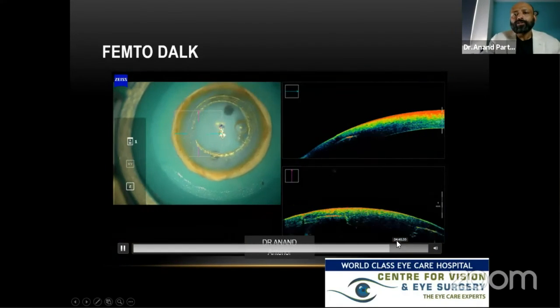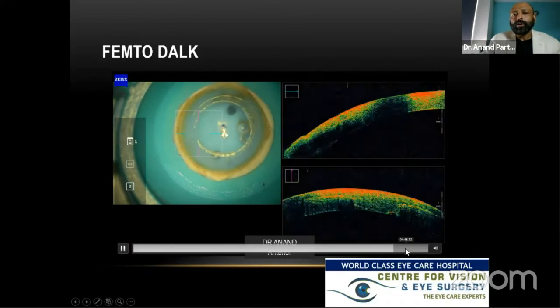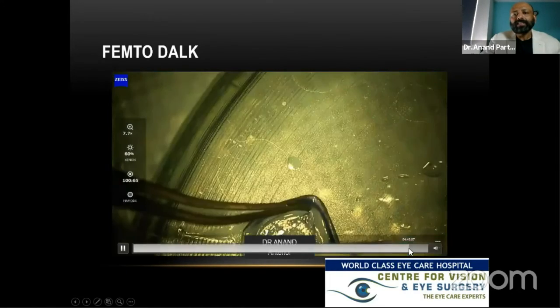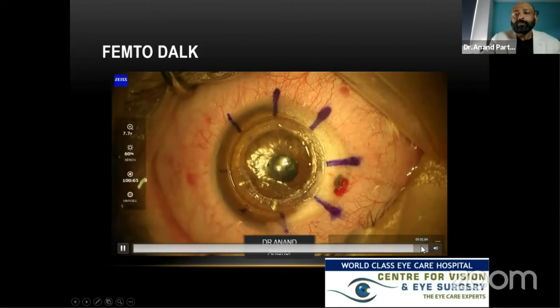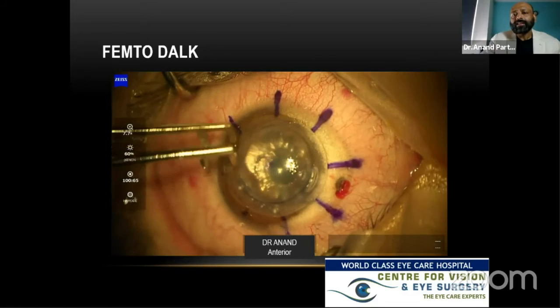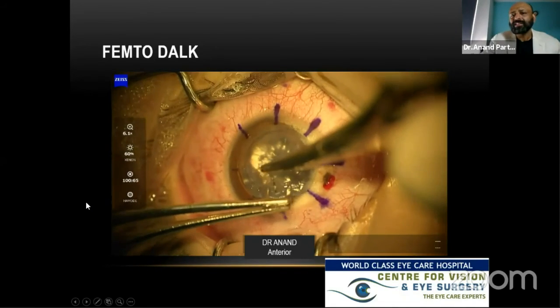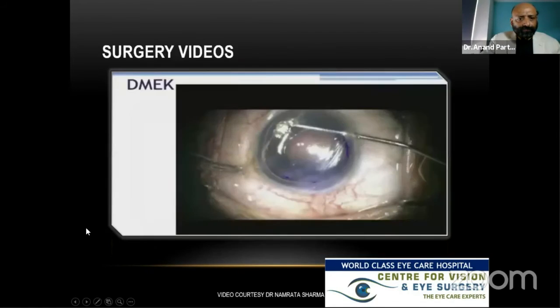This is for the donor. Also, just to make sure you got the step correct, this is important before you remove it out of the artificial anterior chamber, and then basically place it. You can put trypan blue to remove the descemet's and then place it right. The fit is actually quite good, and it's almost like a lock and key fit. And these patients actually do quite well post-op. You just need maybe about 8 sutures to finish these surgeries.